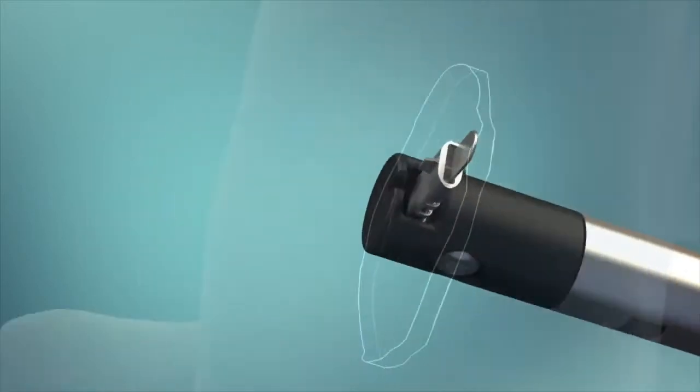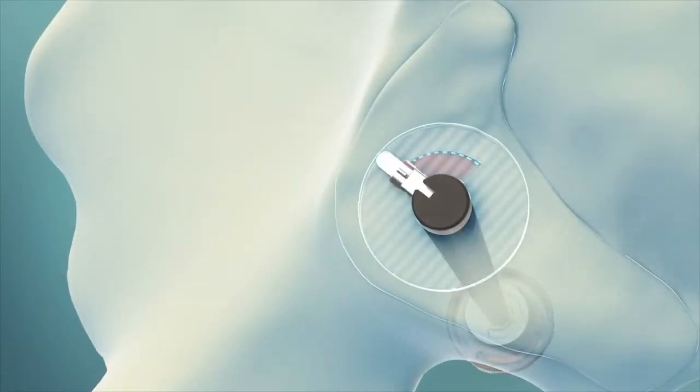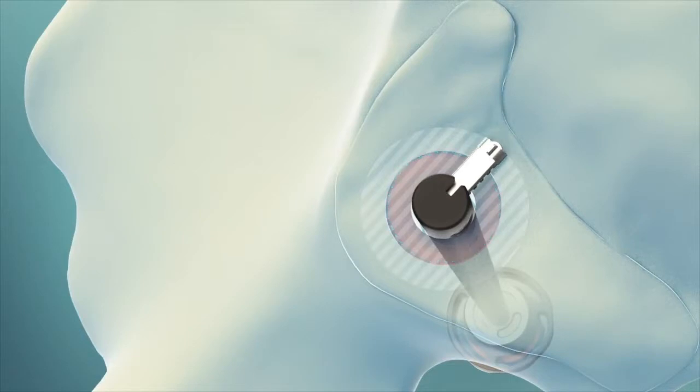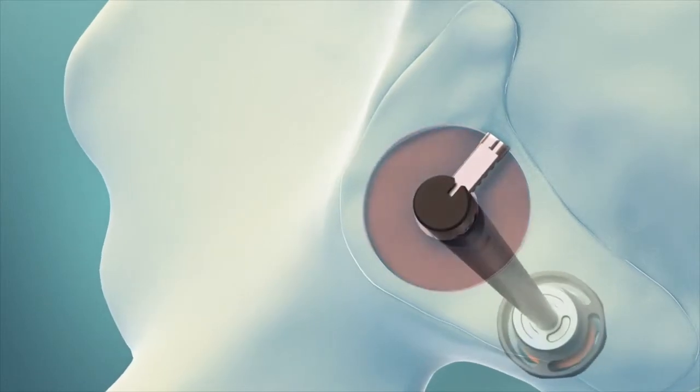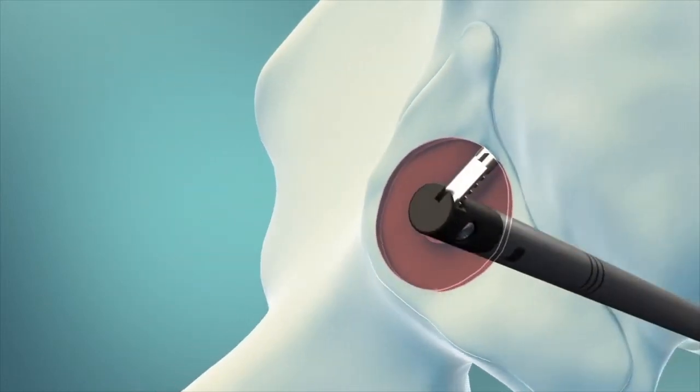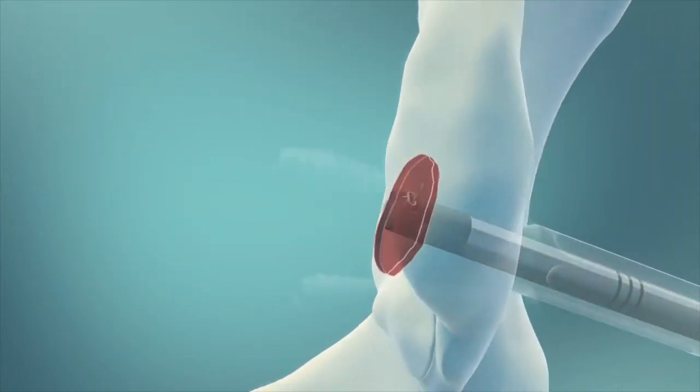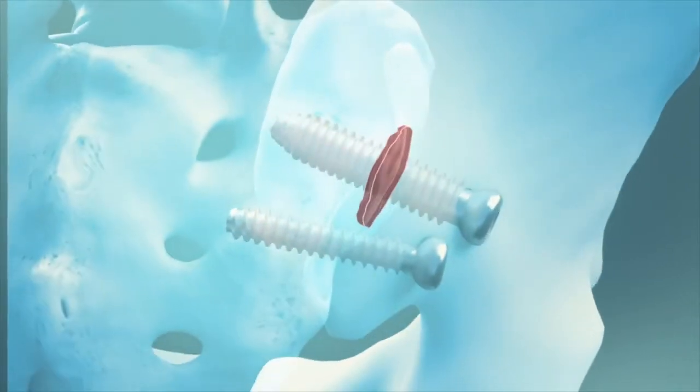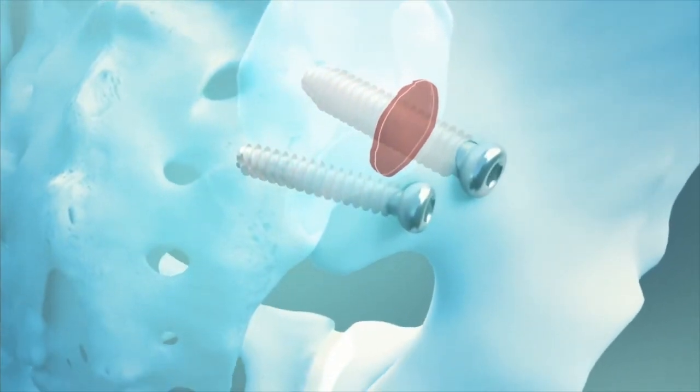The key is the Symmetry decorticator, which removes cartilage and decorticates the articulating joint surfaces. The cavity created allows placement of bone graft. The result is a true SI joint arthrodesis and the best possibility of relief for your patients.